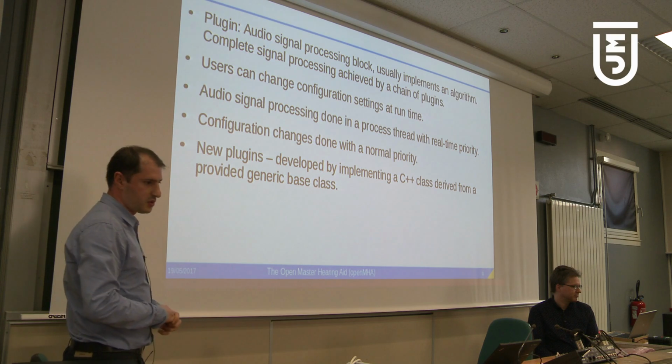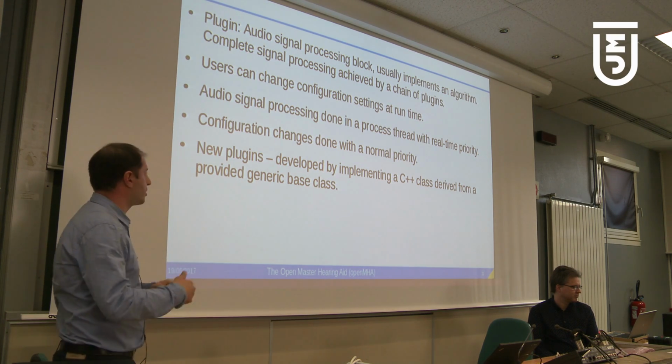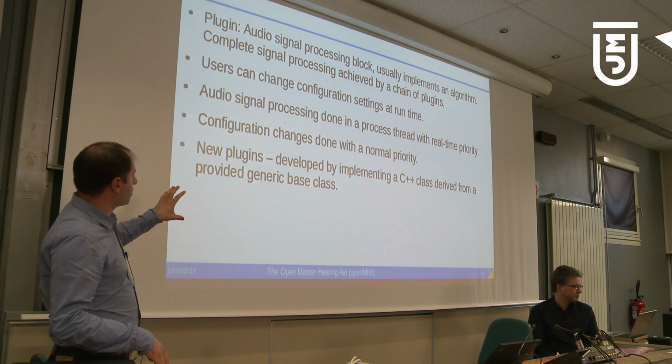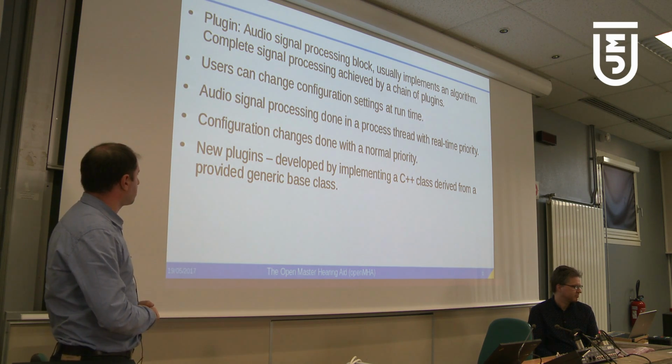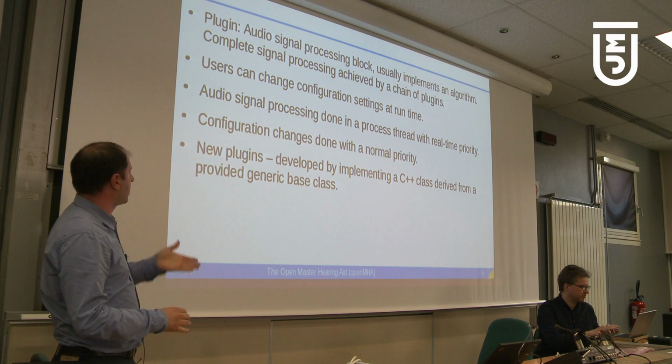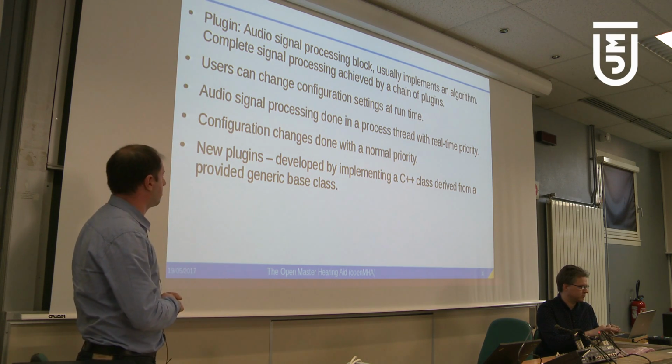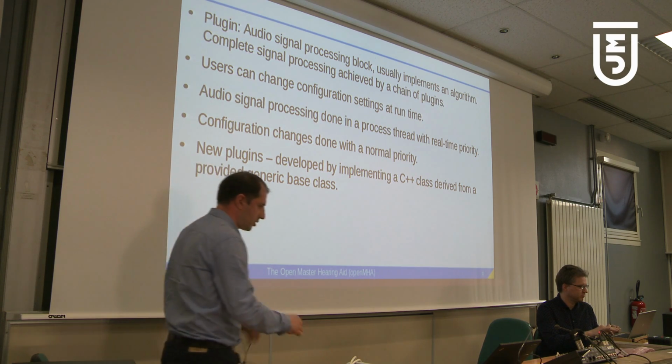So the real-time processing is not disrupted. So for developers to contribute, we provide plugins. We provide a template where these plugins can be implemented in C++.